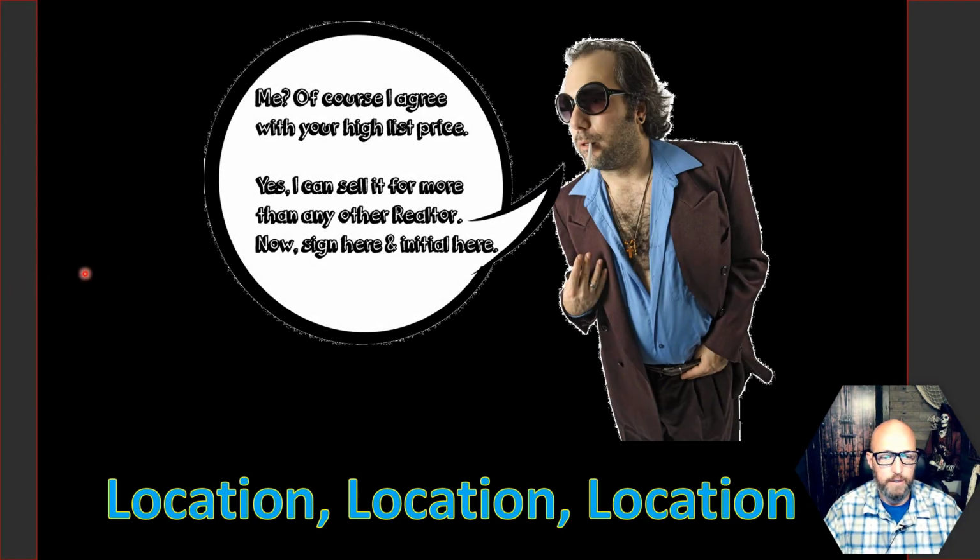And here's our friendly real estate agent. What do they tell you? What's most important for real estate? Same is true for radiographic lesions. Location, location, location. So if I see something that's from below the canal, originating below the canal, pushing the canal upward, I'm not going to start thinking of odontogenic lesions because that's not the proper location. So location tells you a lot.